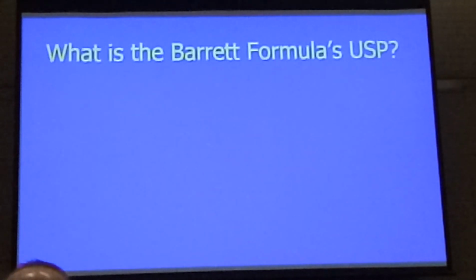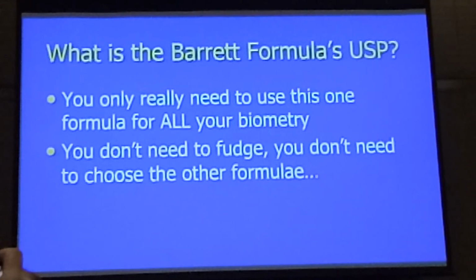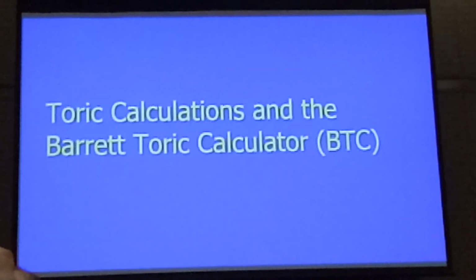So the Barrett Universal 2's unique selling proposition is that you really only need to use this one formula for all your biometry. You don't need to really think too much, and it's available on all biometers, and as I said, it's free. And this protects you a lot.